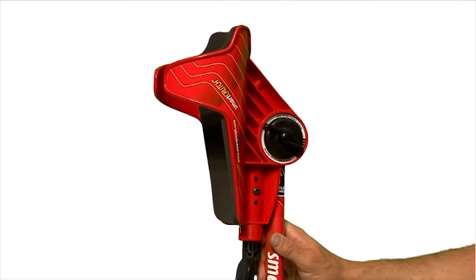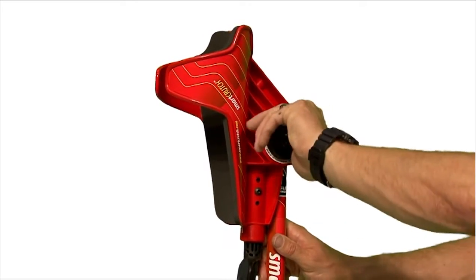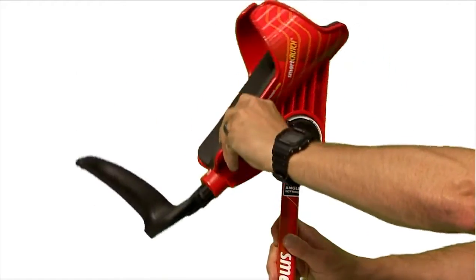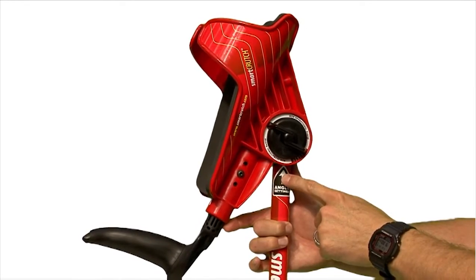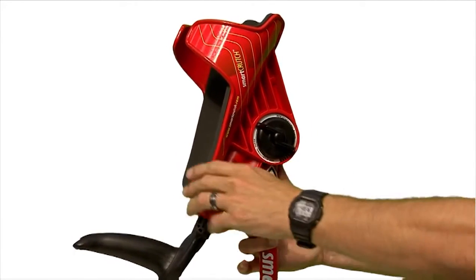The first adjustment you will make is to set your initial angle position. First, loosen the large wing nut located under the forearm platform so that the angle adjustment moves freely. As you can see, there is a position selector and an arrow on each crutch, and we suggest starting with position 1 for the initial setup.